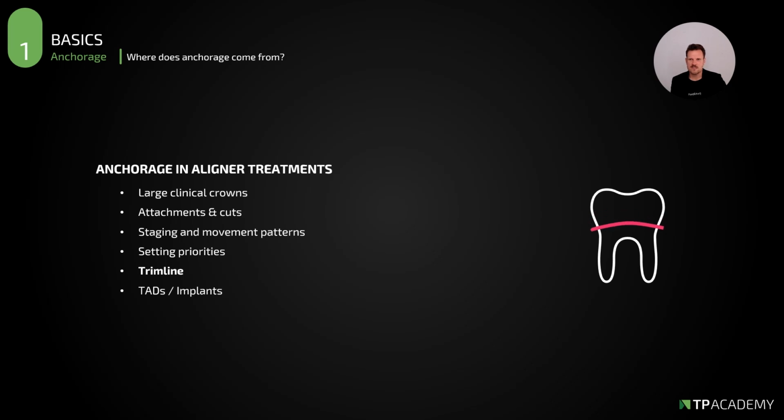Trimline. So is there really an effect of the trimline for your treatment planning process? Can you change the trimline? How to change the trimline? And for what type of cases do you need to change the trimline? Is it possible with every software to change the trimline? That's a very interesting topic.